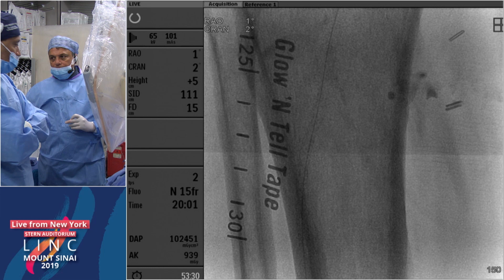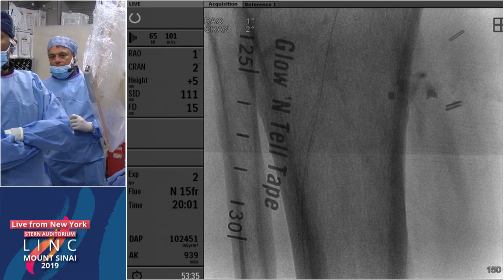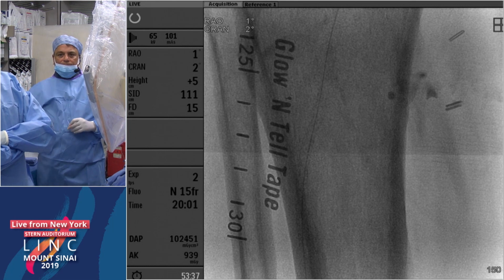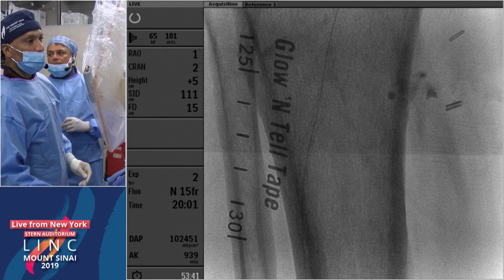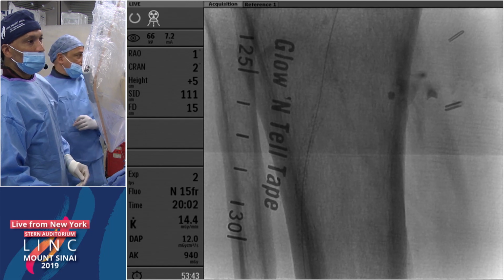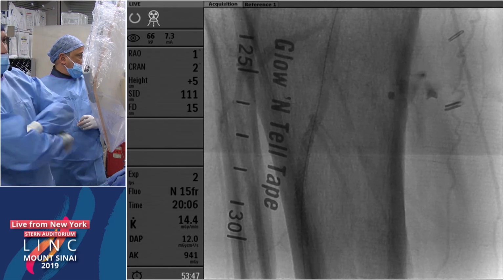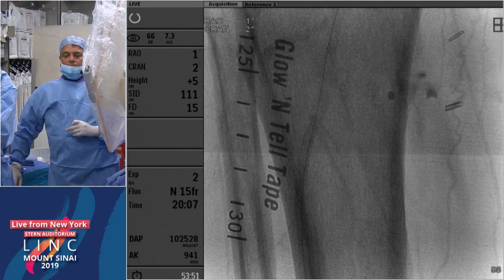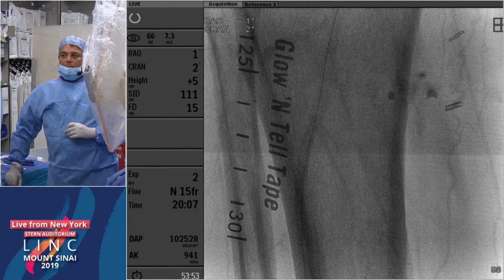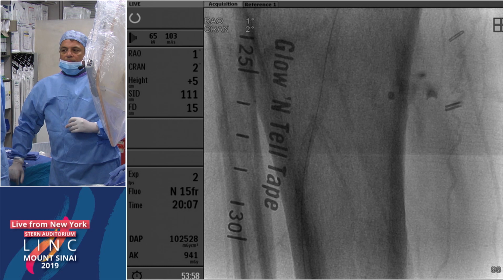Yeah, I agree. I think all coronary drug-eluting stents perform relatively equally in the tibials. The caveat being, of course, that the data really is for these shorter lesions, in the range of around 30 to 40 millimeters. So I'm excited to see the results of the SAVAL trial, because I think having a self-expanding stent with drug elution may have some significant benefits, especially for longer lesions. Yeah, I don't disagree with any of that, and certainly the data is better for DES than anything else in the tibials in terms of patency rates.